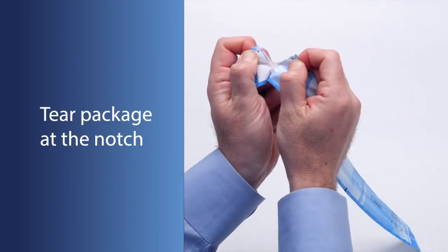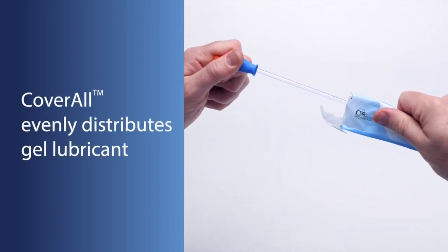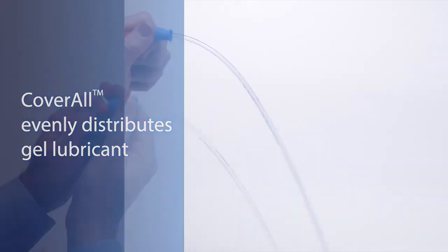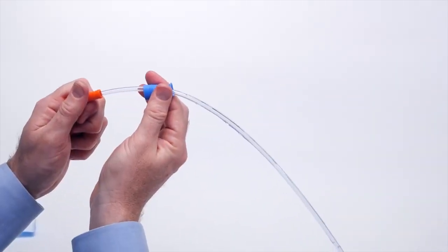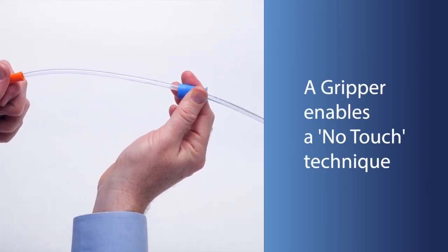As the catheter is removed from the pouch, a unique coverall feature ensures even distribution of gel lubricant. A gripper prevents direct contact with the catheter for clean, controlled use and reduced risk of exposure to bacteria that can lead to infection.